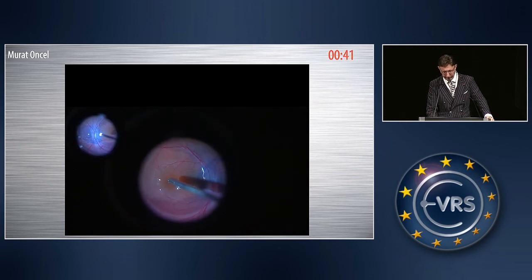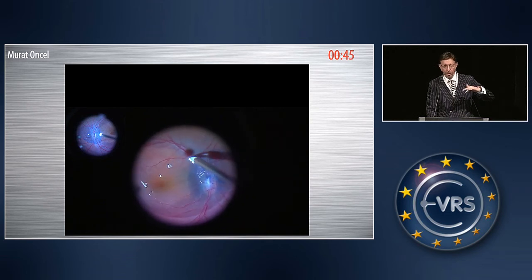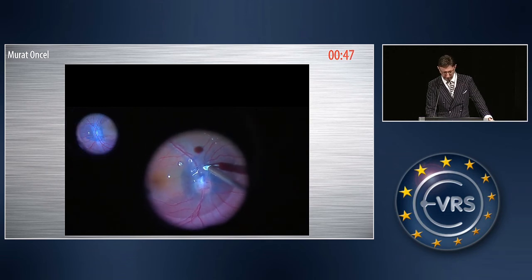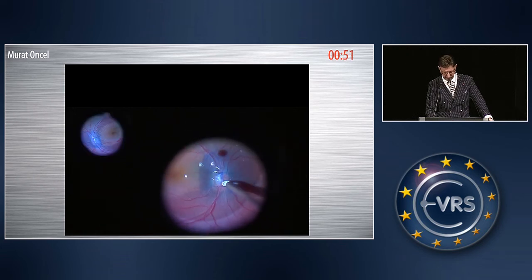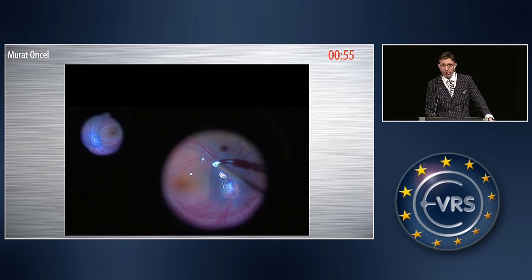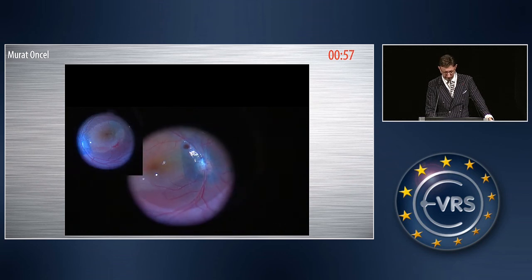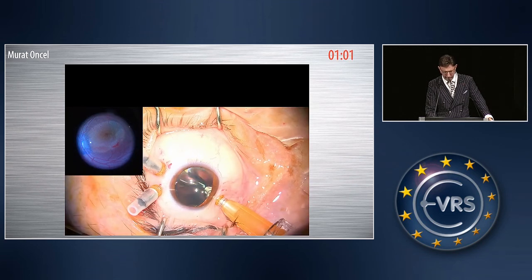Here is the perfluorocarbon liquid, and you see the whole ILM flap is totally covering the optic disc pit — totally covering the optic disc. After the air-fluid exchange, I removed the perfluorocarbon liquid. And here you see the injection of heavy silicone oil.